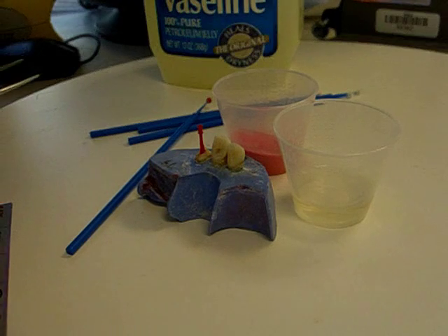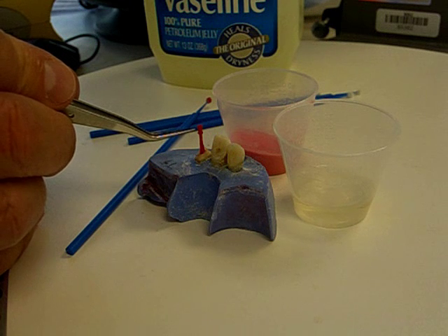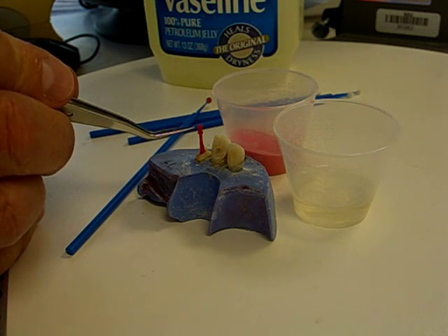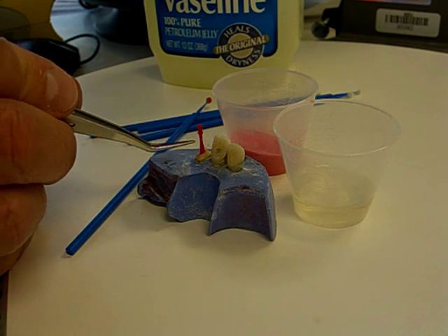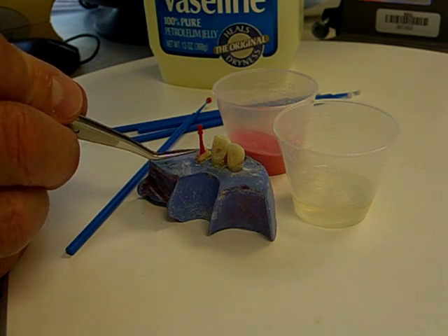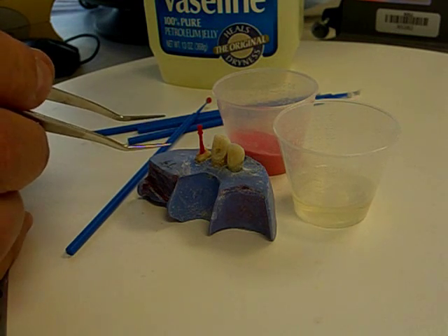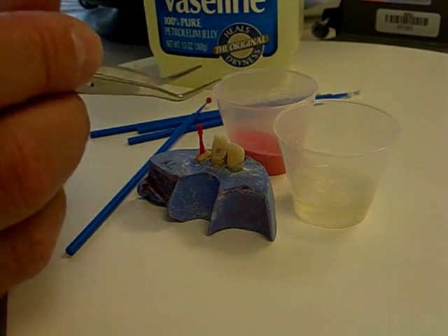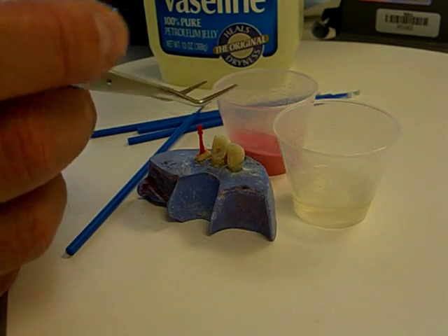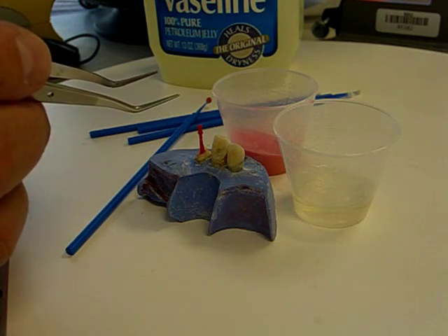The sprue pattern is now in the canal. The head of the sprue is at the coronal end and there's some excess GC pattern resin polymer and monomer right at the access opening to that canal. We're going to alternately remove and replace the sprue pattern so that we don't lock into any undercuts that might be present in the canal space.